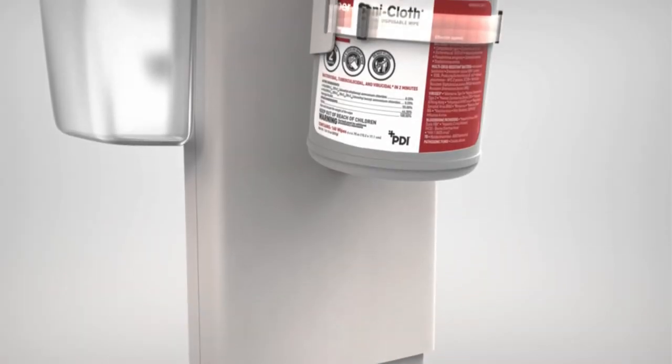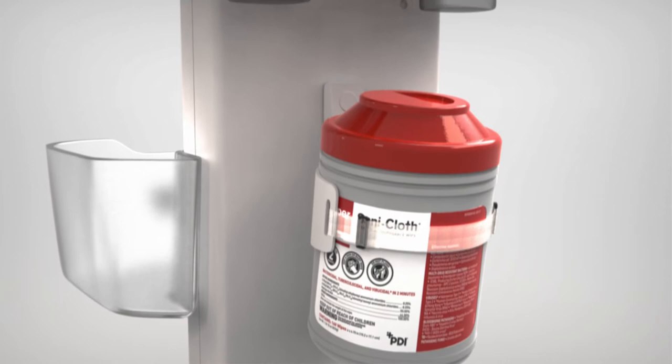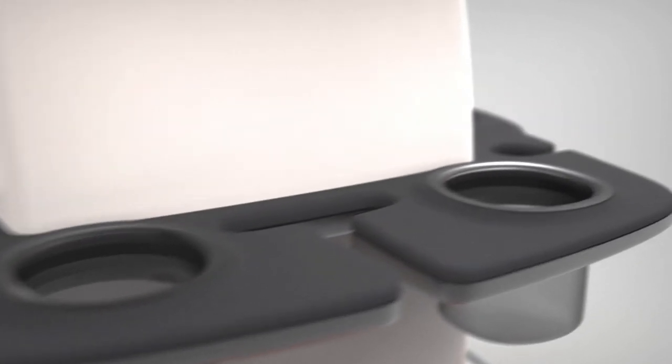Above this, there is a storage location for disinfection solutions. Cleansing wipes can be secured here with a velcro strap. Above this storage apparatus, there is additional storage for ultrasound gel and cable management features.